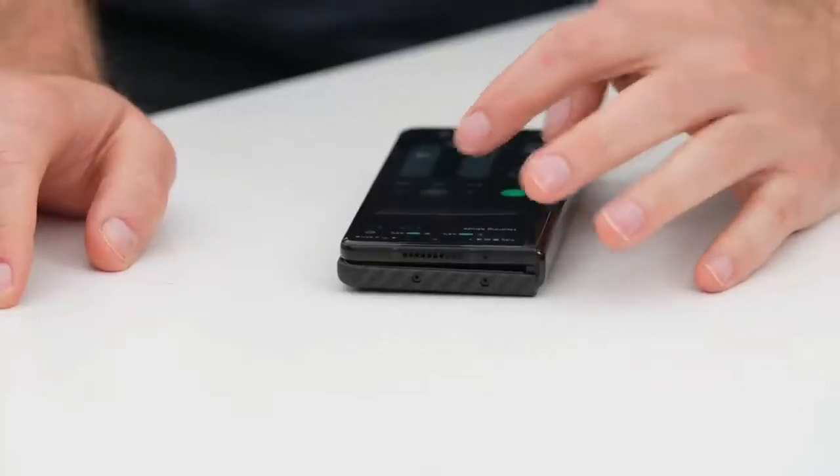Okay, so yes, this is the test we're doing. We have 2 giant speakers on either side of this desk, and they're gonna surround us with the sounds of a cafe. We're gonna simulate being in a cafe. And I'm gonna play with the settings a bit. I'm gonna try to cut out most of the cafe noise and zero in on Mo's voice exclusively. Testing. See if this is helping, making it better. Testing, 1, 2, 3.